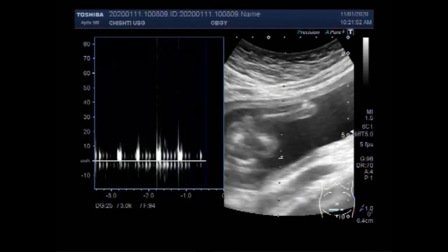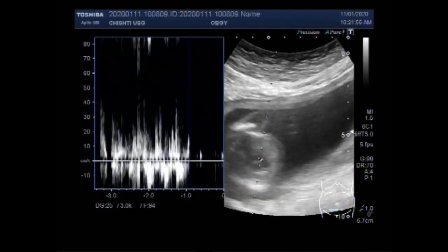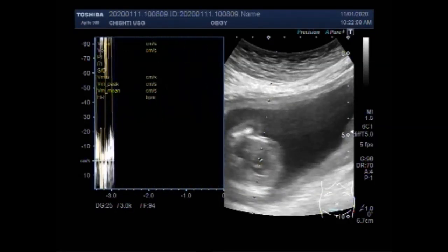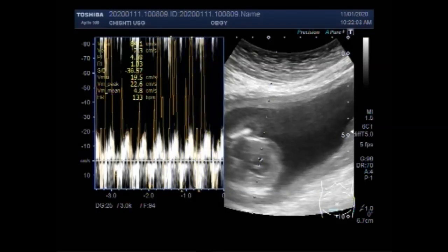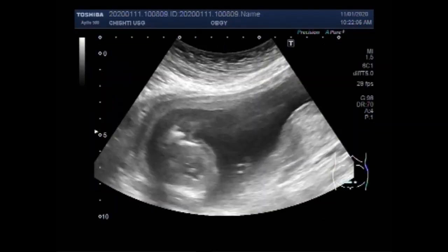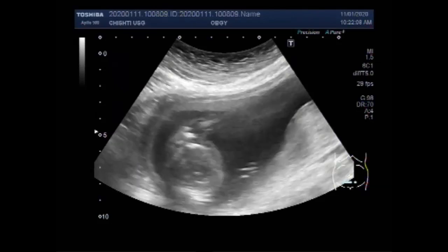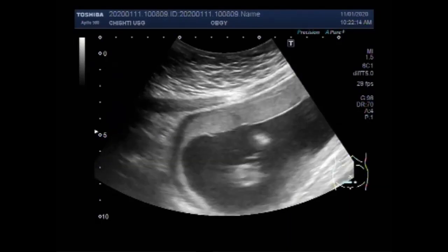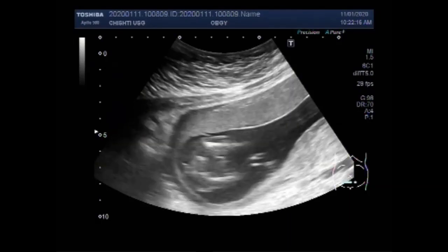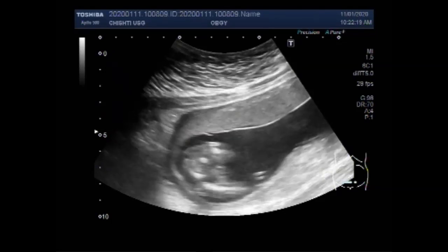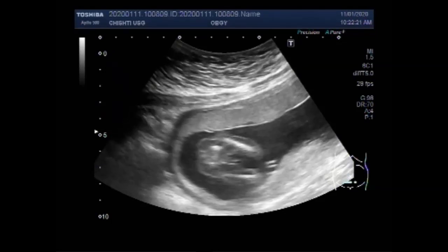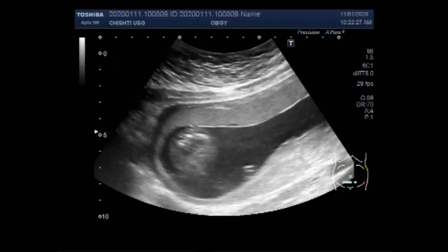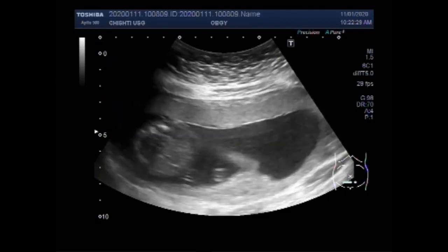Again you can see the fetal cardiac activity. Now you can see the fetal lower limbs. It looks to be male.